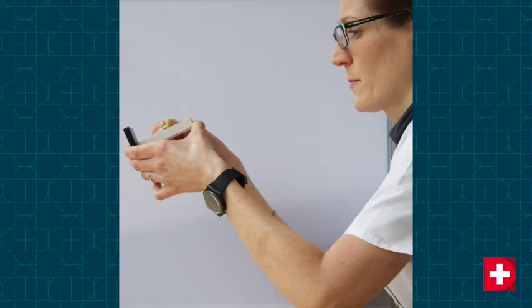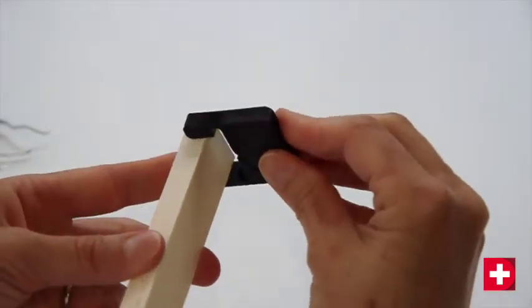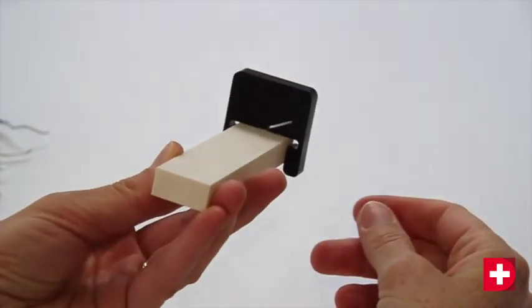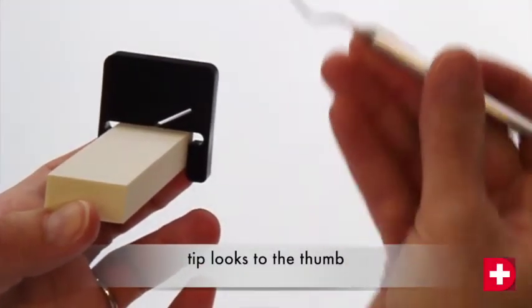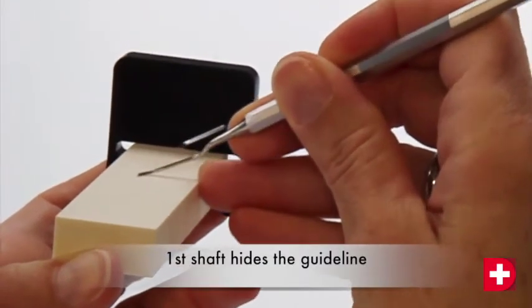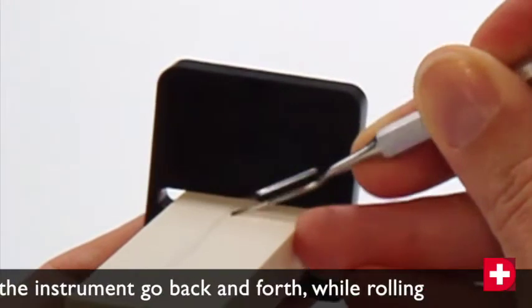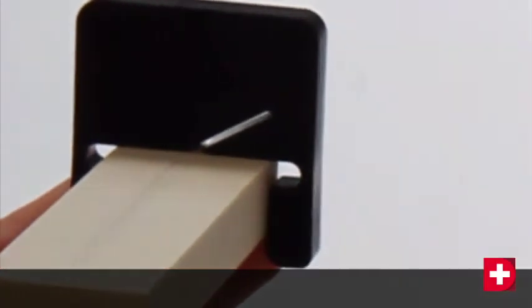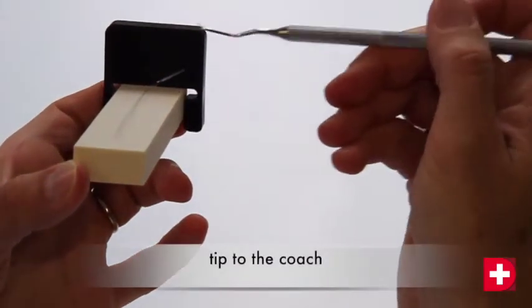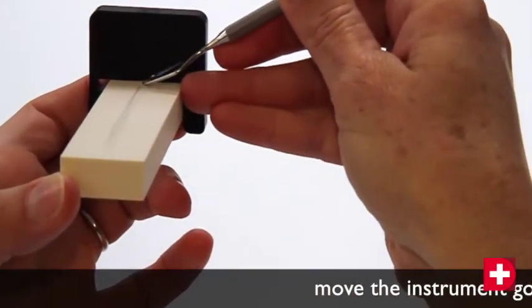Let's take for example the Gracie 7-8 curette. Mount the Gracie coach — this is used solely for Gracie curettes. The point of the instrument should always be pointing towards the thumb or the coach, depending upon which side of the blade is being sharpened. The lower or terminal shank should cover the guideline and remain parallel to it. Once you have the correct position, you should move the instrument back and forth over the stone whilst rolling the handle between your fingers. This will enable you to follow the curve of the blade. You should avoid using force — simply slide the instrument over the stone. The wider your movements over the stone, the more effective you will be.